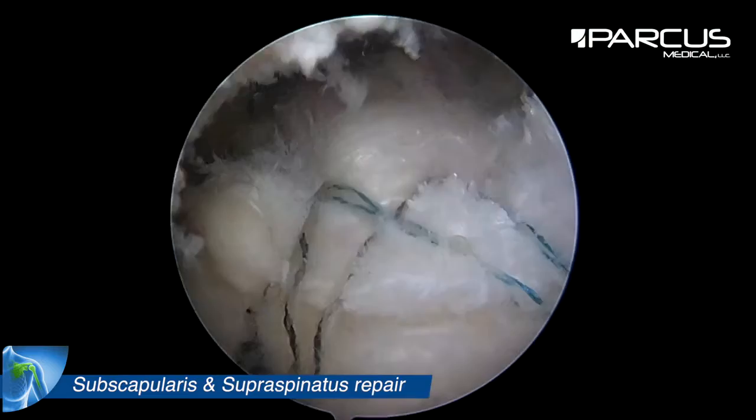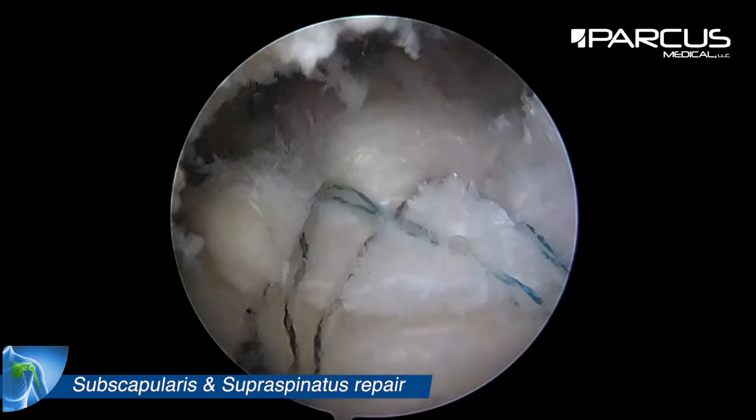This way we have repaired this cuff tear in a double row manner with a good result.